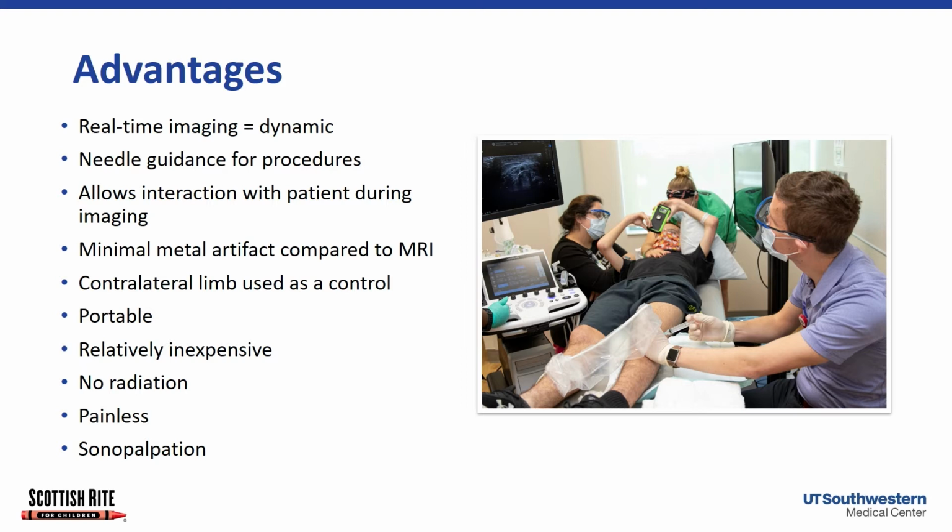Another good thing that patients really like is you have the ultrasound machine in the clinic exam room with them. You put the probe on them, they can see the screen with you, and you can point out things and say, hey, this looks good, or this looks a little abnormal. This can help guide our treatment or therapy and may help promote some confidence in them with the things you're asking them to do in regards to the treatment plan. There is some metal artifact on ultrasound. In some cases, it can be less than what we see on MRI, which may help as well.